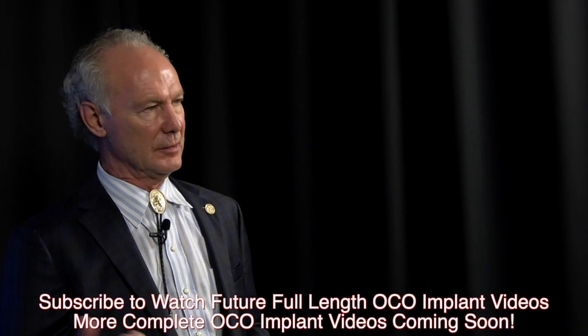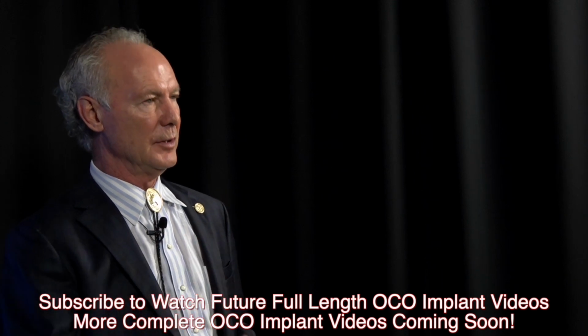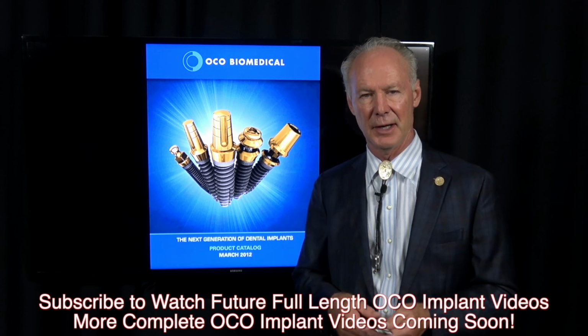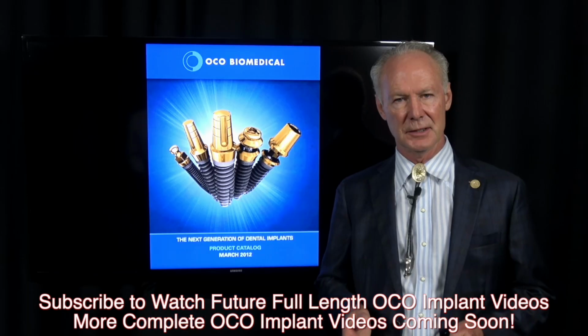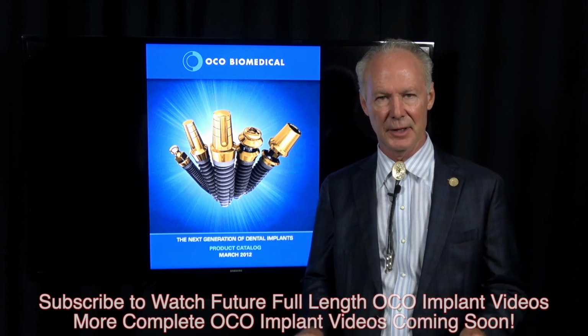I'm going to have more videos on cases that I've done with the OCO system. You'll really like it once you get the hang of it, and my assistant knows this front and back. So that's the OCO dental implant system. It's got all the components I'm looking for in a dental implant system.